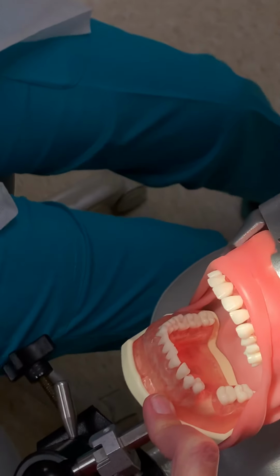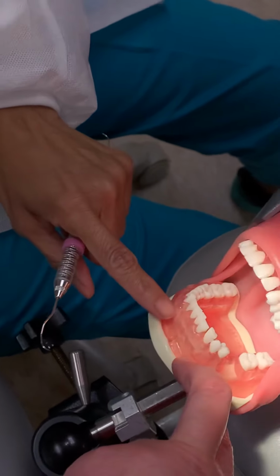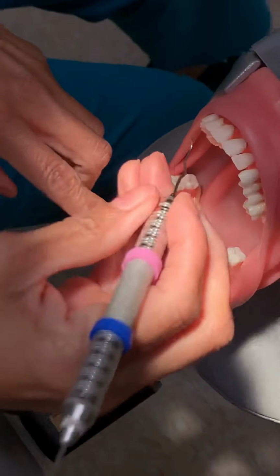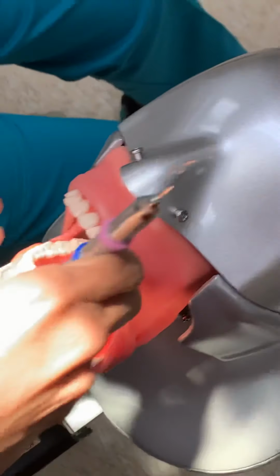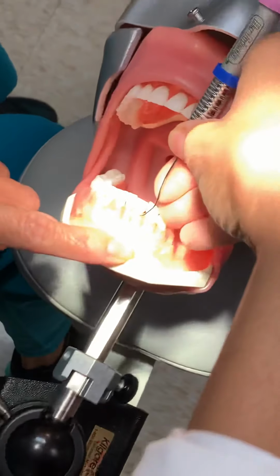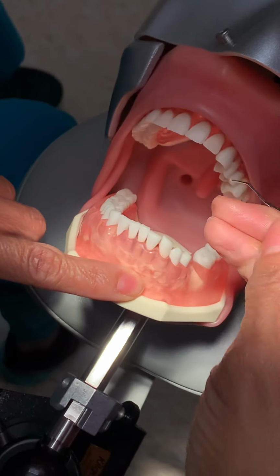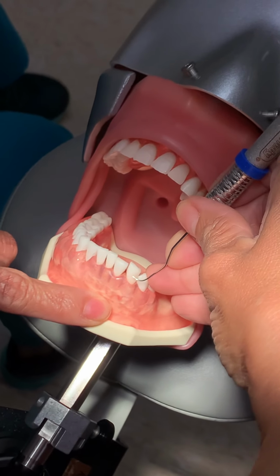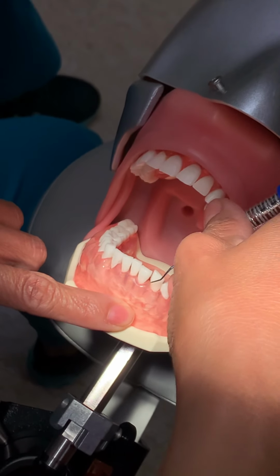And for the mandibular, I think Ms. Brooks actually. Ms. Brooks. So for the mandibular, if you're going to do surfaces towards me, same 8 to 9. My terminal shank is going towards the tooth. Starting here again at the get ready zone. Get ready zone. Come all the way in approximal.